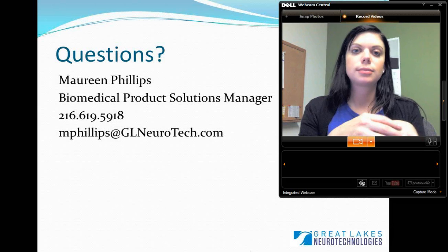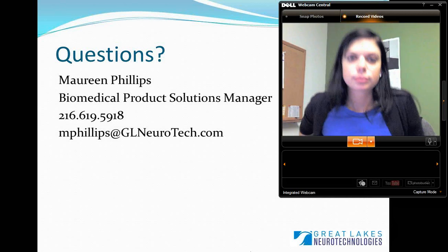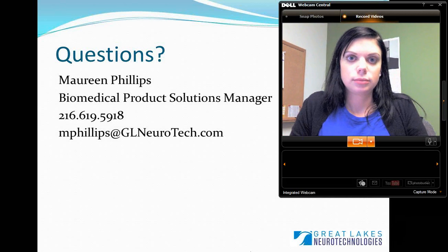Okay, can you pick up alpha, beta, theta, and delta waves from just one channel? You can.